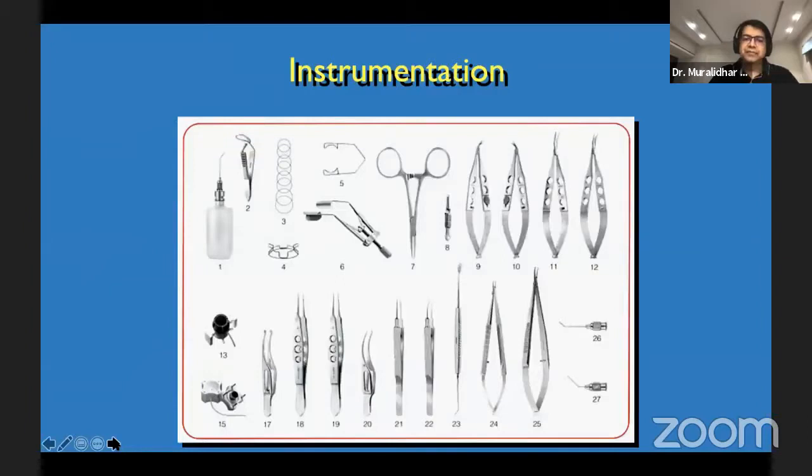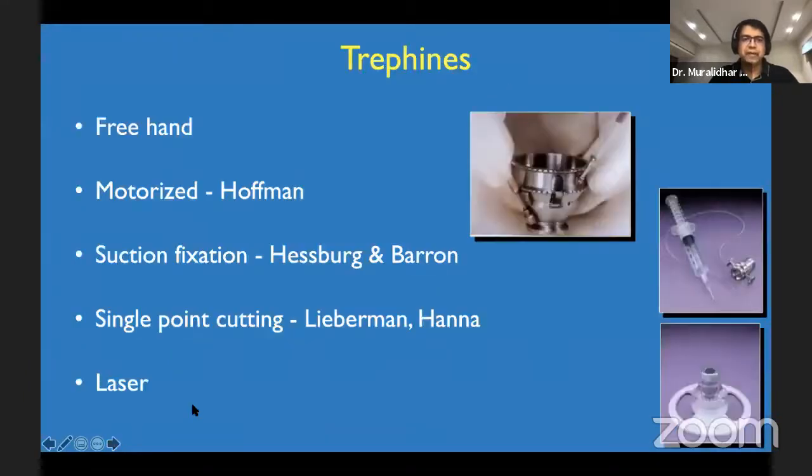And these are the setup instruments. As Ashrafullah was asking me to give an entire detail about the instrumentation and spend a little more time on the technicality. It's very, very important to have a preoperative preparation and preempt any intra- and post-operative complication one may anticipate in these cases, that would actually help in achieving a much better outcome.